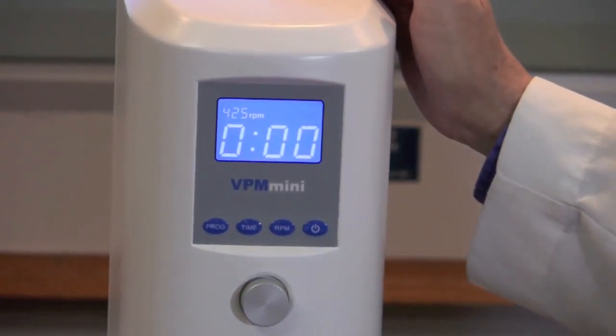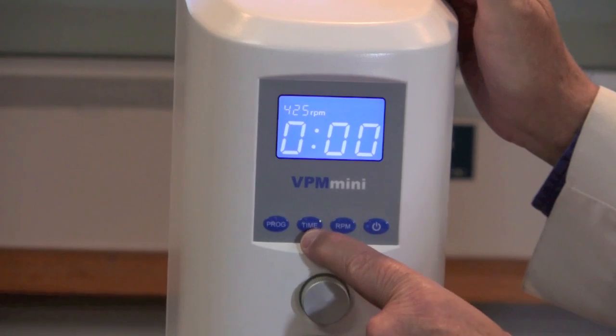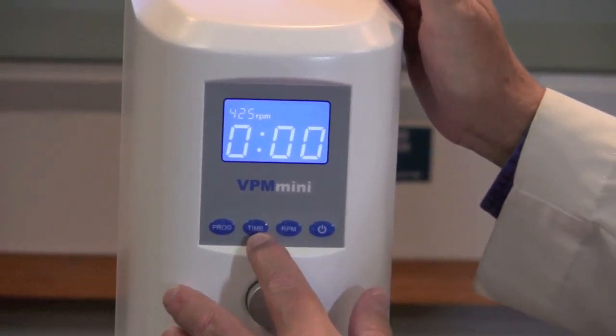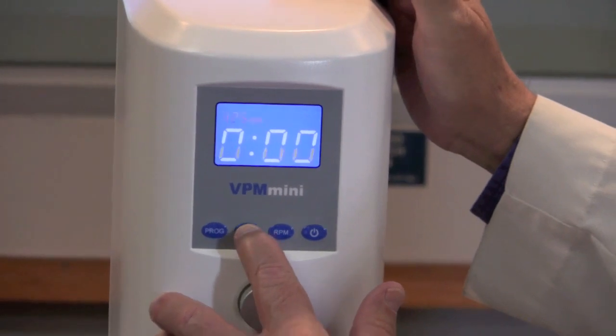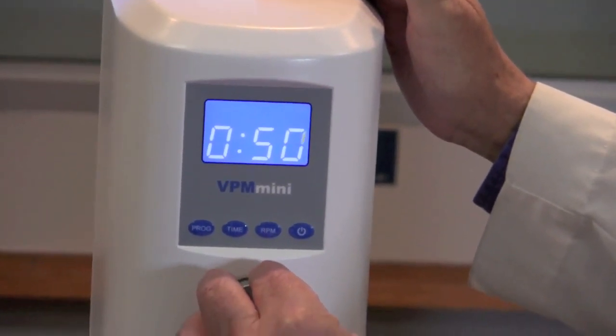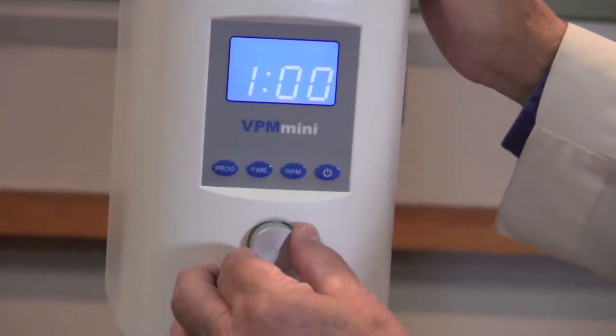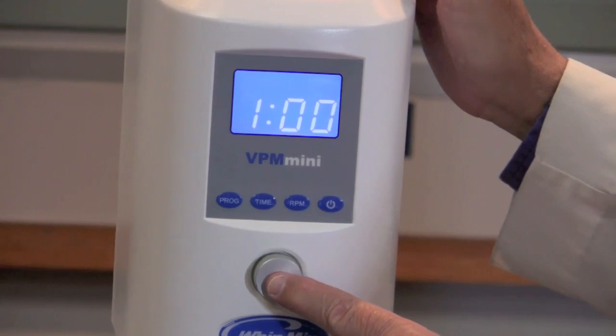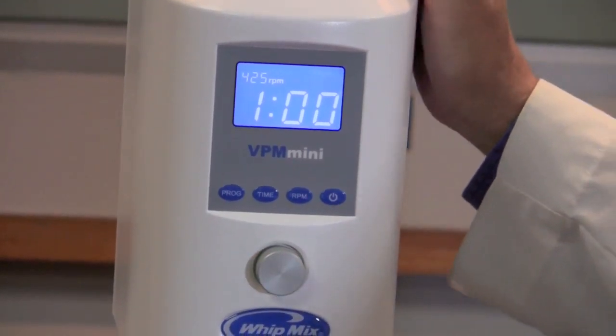Once you've done that, we're going to select the amount of time that this particular program is going to run. Press the time button and select the amount of time you would like your program to run. Once you've done that, press the silver button again and you've programmed your program.